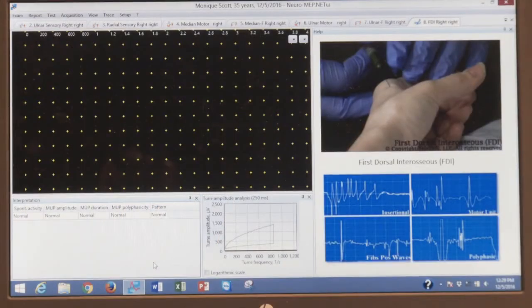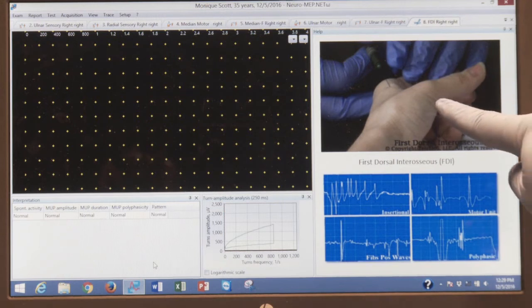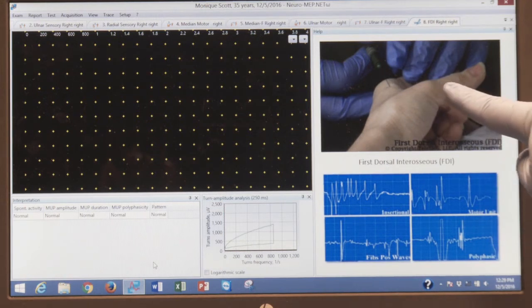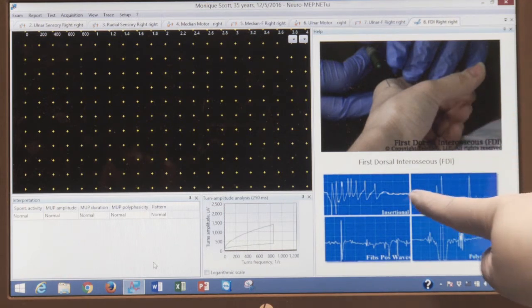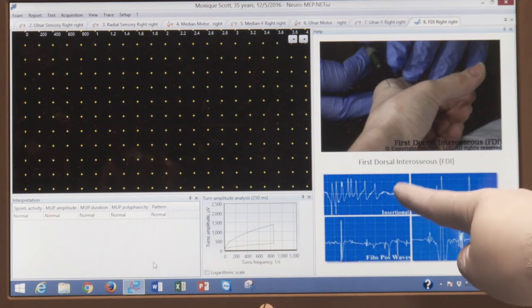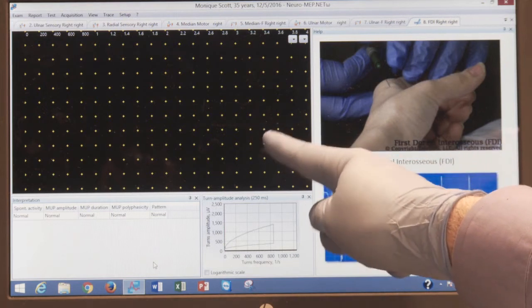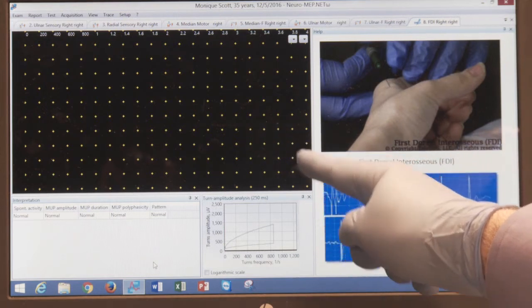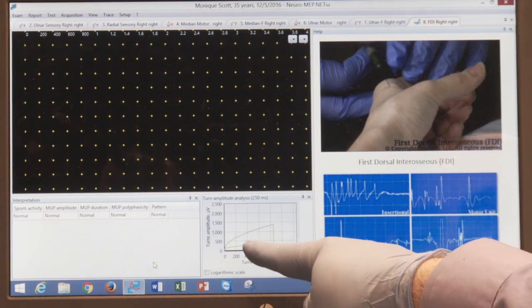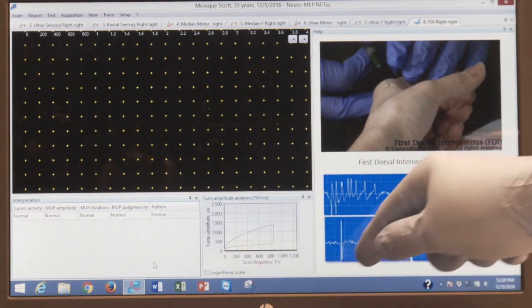Now, if you look at the screen, you can see the area where we stick the needle inside the muscle right here. And I'll explain this to you later. You will see actually what the potentials from the muscle activity looks like. This here is where you see the signals from the muscle. And this area here shows the triangle, which we call the cloud.